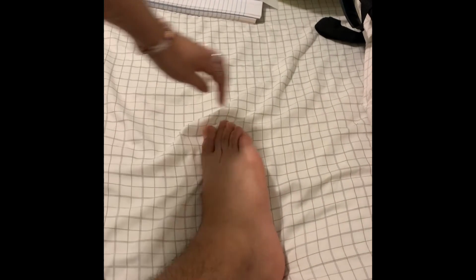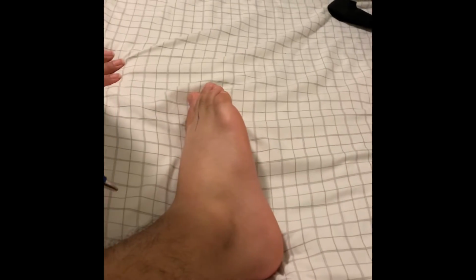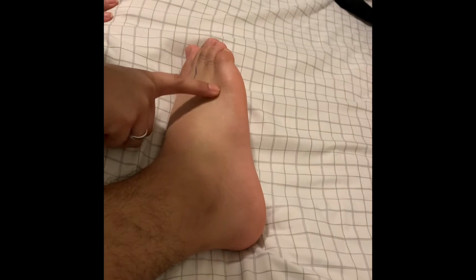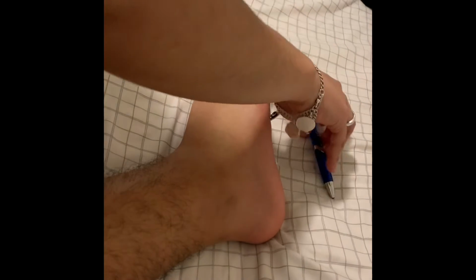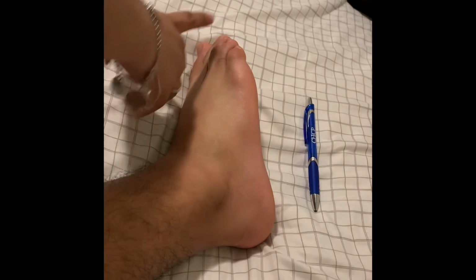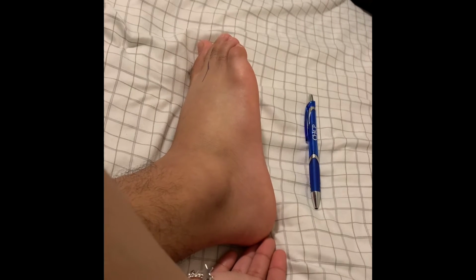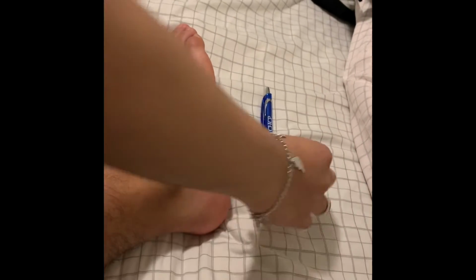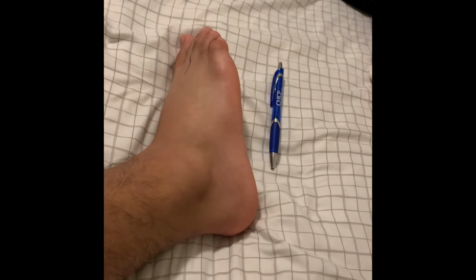leg towards me. That way the foot can be facing as if it was facing me. So we have to make sure that the central ray of the machine is like this, and you always want it to be around here. That's the best way that you can have the picture perfectly. And like I said earlier, you want the toes and the heel to be present on the picture, or else you're going to have to retake it again. So that is our position right there. We have our marker here, and then we go ahead and take our oblique picture.